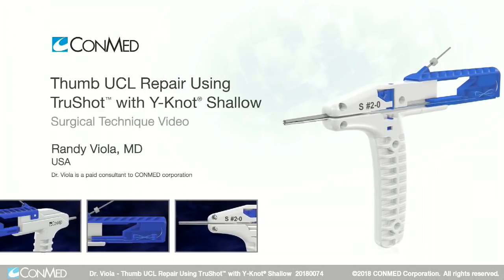I'm Dr. Randy Viola and we're at the Stedman Clinic in Vail, Colorado. Today we're going to perform a skier's thumb repair using the TrueShot Ynot.